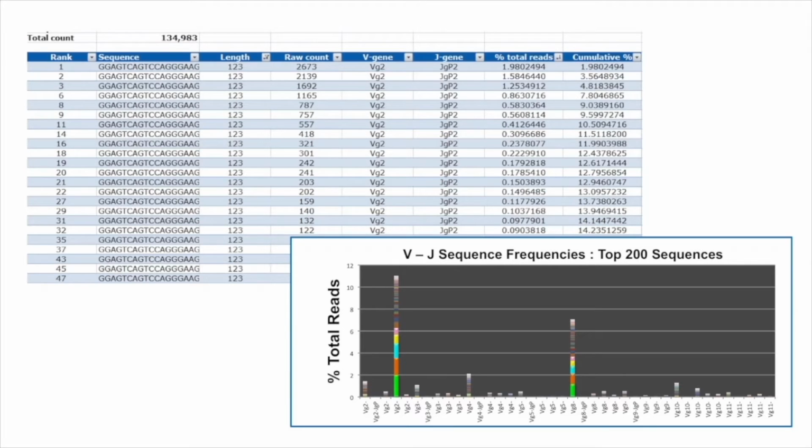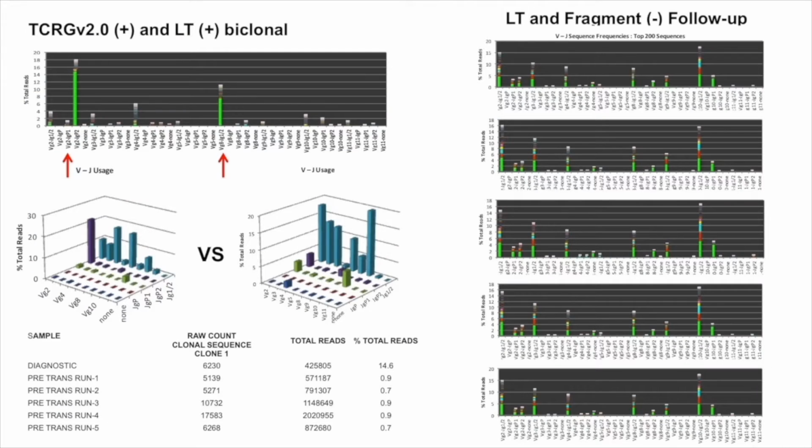So you actually have to go and look very closely at these sequences and see how different they are and if they actually do belong to the same original clone, but it's just that you have a little bit of mutation associated with the therapy itself. But for this case, clearly you have the 2 clones are present. And when you do the analysis of that pre-transplant sample, you can go and look for that specific clone.